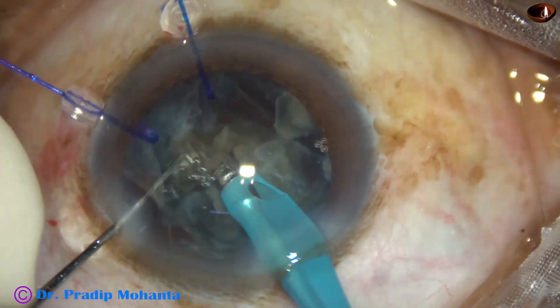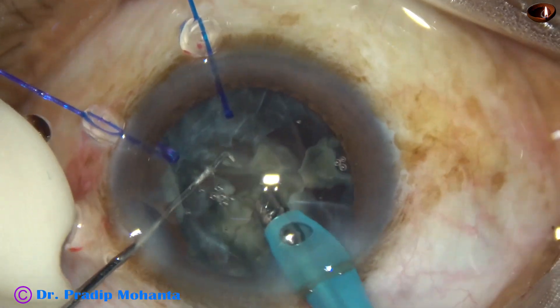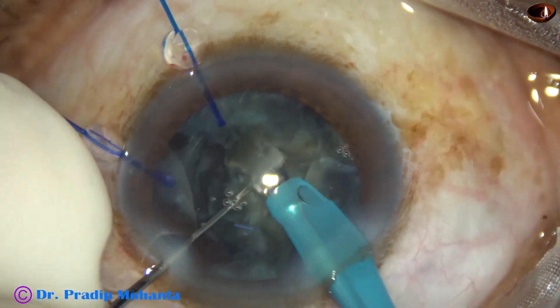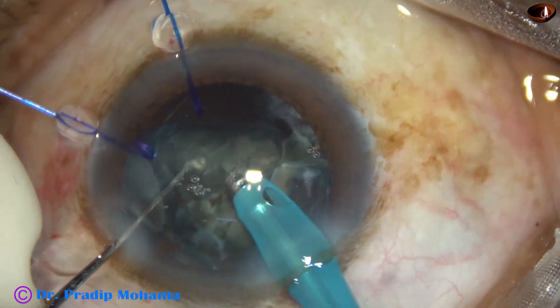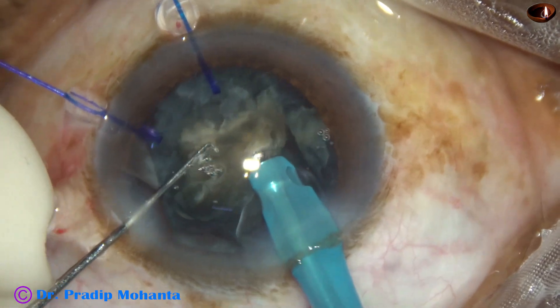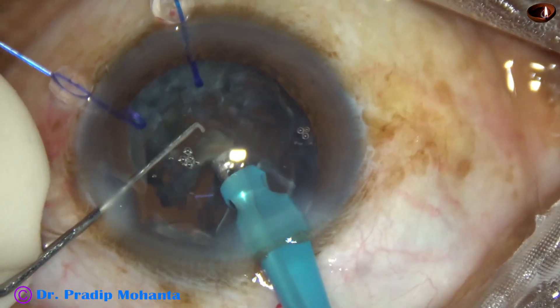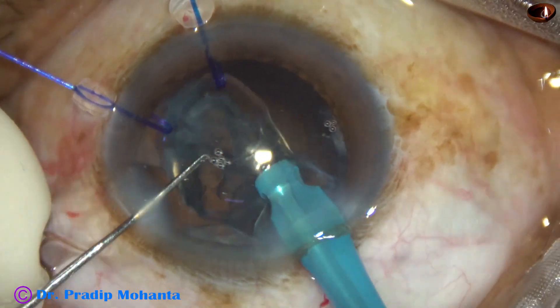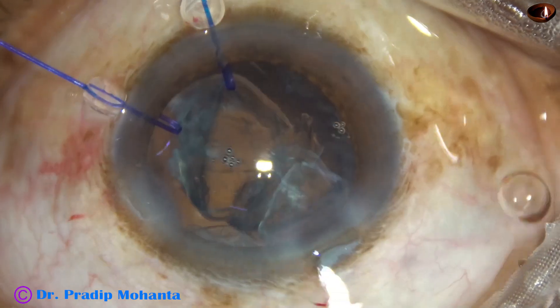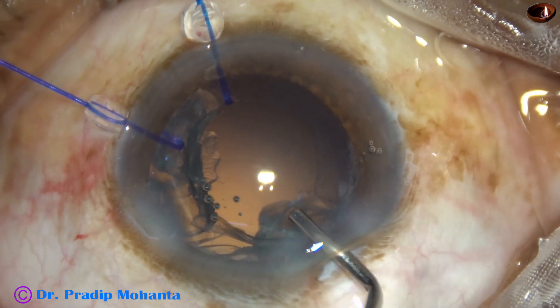The remaining zonules will keep the bag in place. Now towards the end of nucleus management, the problem is that when there is zonular dehiscence, the posterior capsule may come very easily to the tip. My plan is to keep an epinuclear shell as a protector of the capsule — remove only the hard part, then implant the intraocular lens. I come out and inject 2% HPMC. You can see the bag intact.